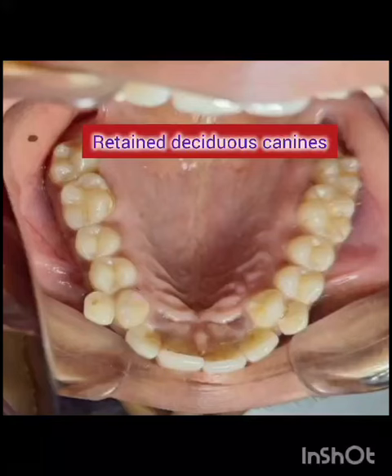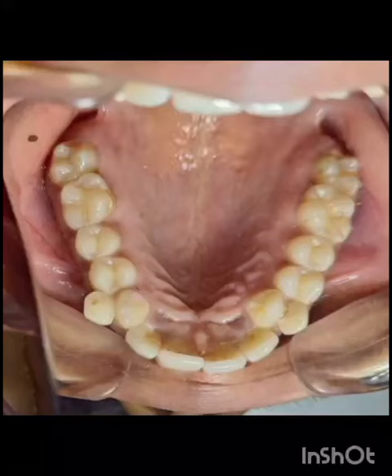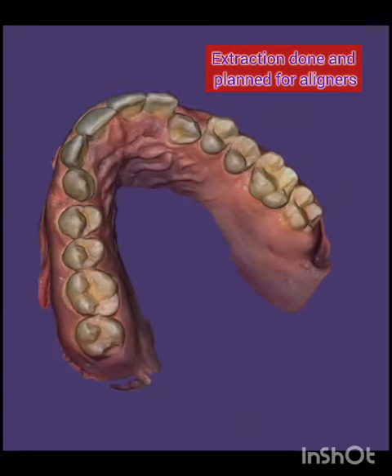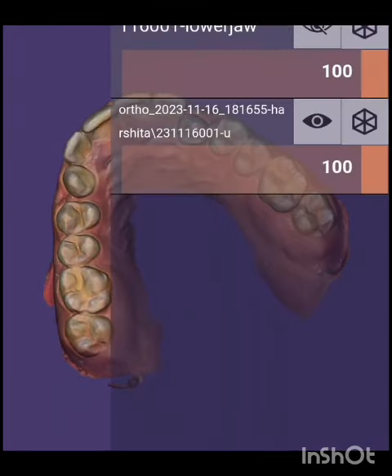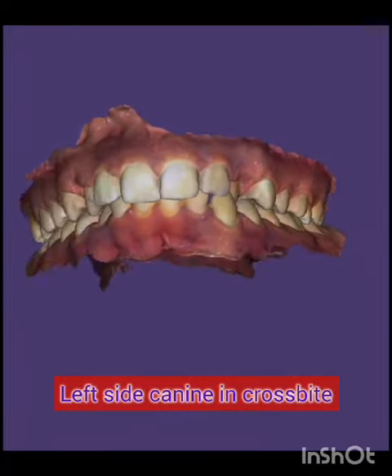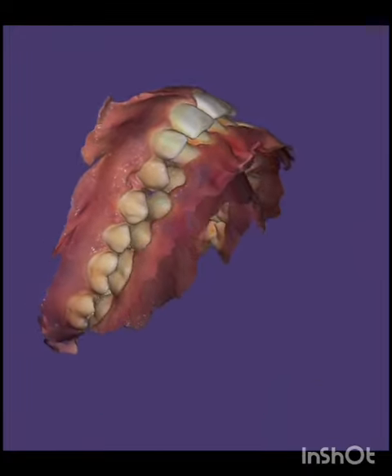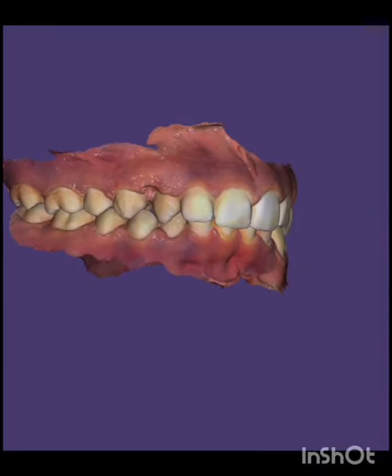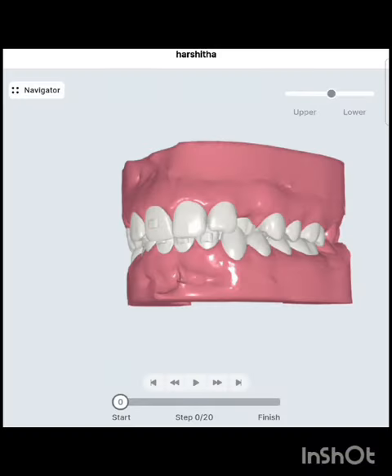In this aligner case, the retained deciduous canine was extracted and treatment was planned with aligners. You can appreciate the crossbite of the upper left canine — it is in crossbite. We raise the bite with the aligners.